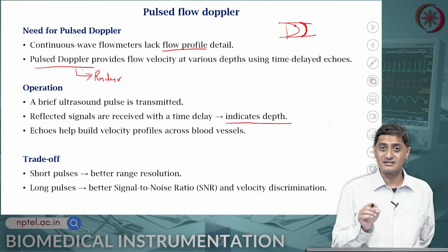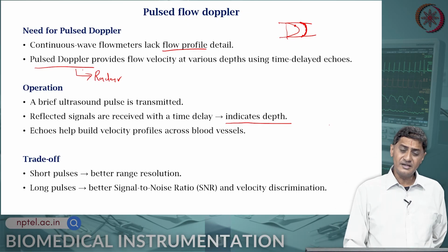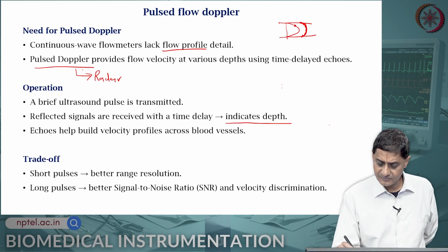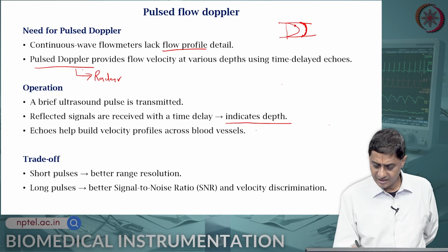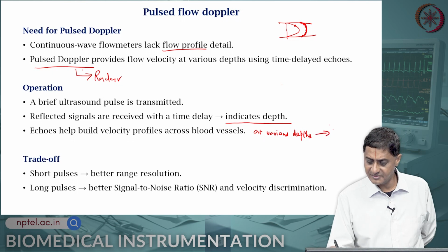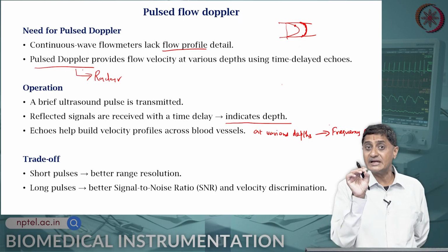So, the depth is indicated by the time delay itself, and you examine at various depths, you examine the frequency shifts at a given depth.